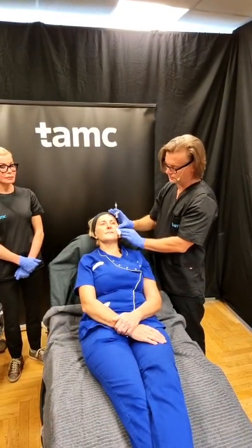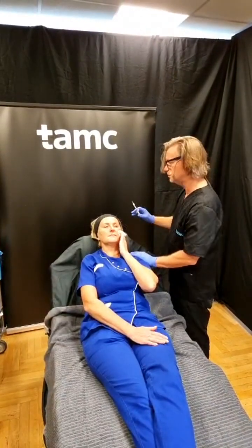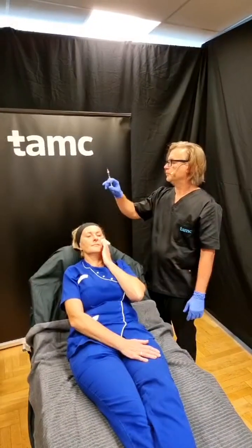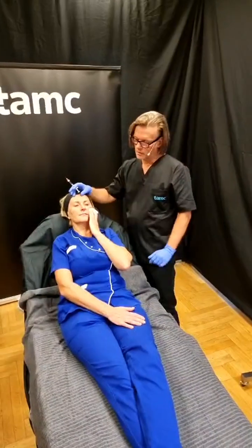Is there any question from the audience? Okay. Tom, I have a question. Could you please tell us the total amount per site that you are going to use with the Restylane? I've been using 0.3 now.